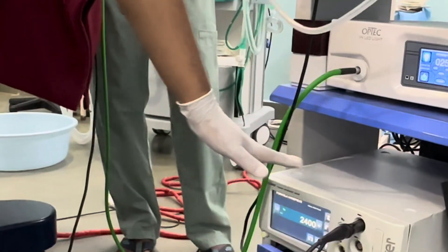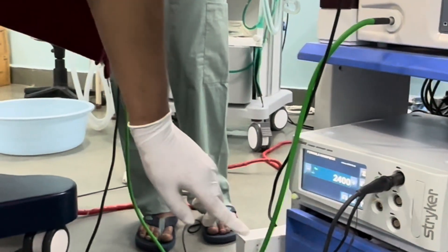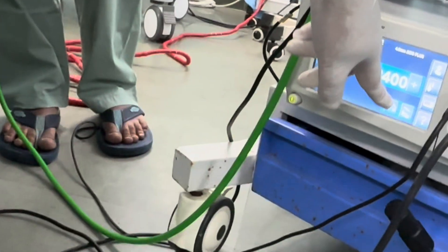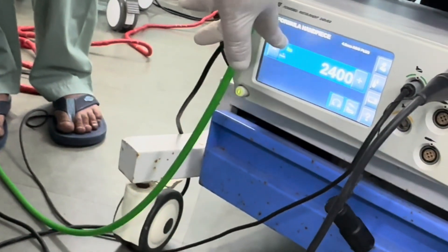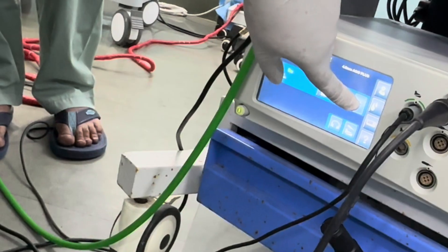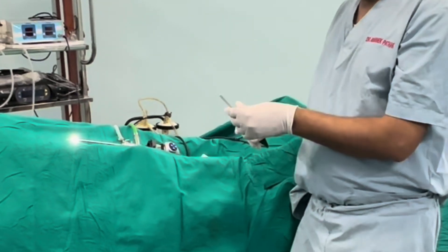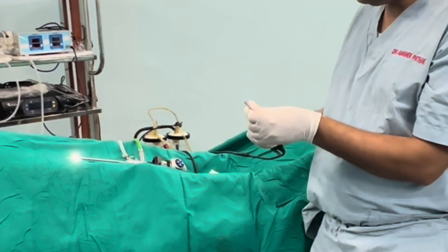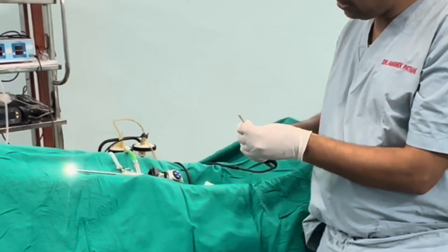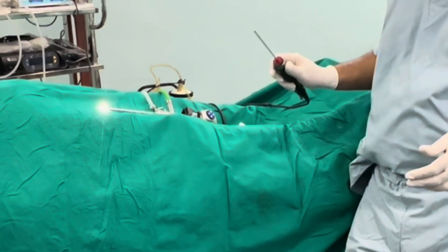On the shaver console, there is a speed and mode setting that can be changed via the touch screen. Available modes include oscillating mode and forward mode, with speed adjustable accordingly. The shaver blade attaches to the handpiece with a quick locking mechanism — there are slots for it and a snapping mechanism to lock it in place.